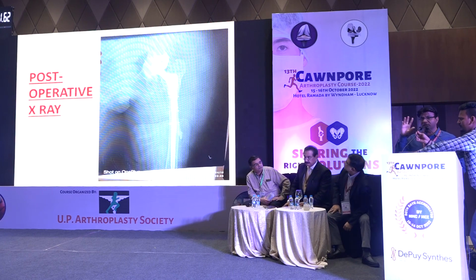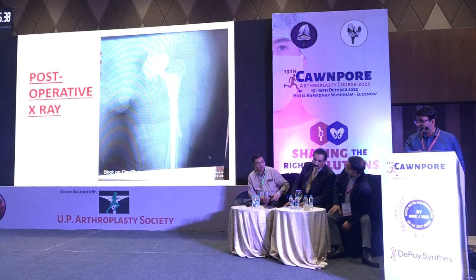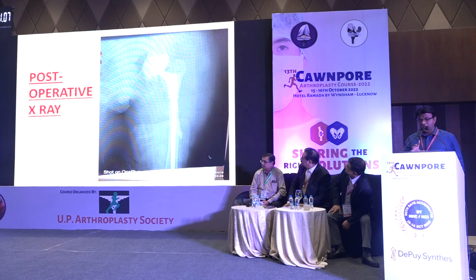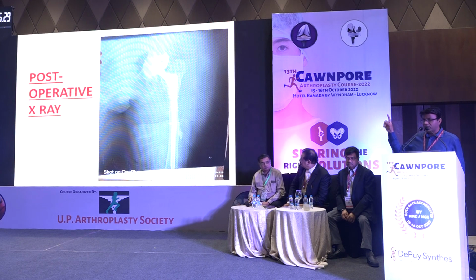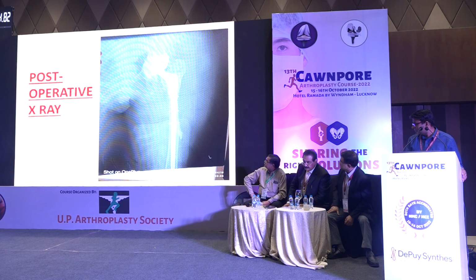As the posterior superior cortex was there, the dome was sufficient. Due to protrusio, I used a tri-flange cup, and with the tri-flange cup, I used a cemented cup. And especially in these cases, as Dr. Sanjay Agarwala said, we have to be very careful about the version and inclination of the cemented cup. It should not be vertical. We have to be very careful. So I used the cemented cup, with a good posterior superior dome, and screws were sufficiently engaged in the cortex, and I put a long cemented stem.